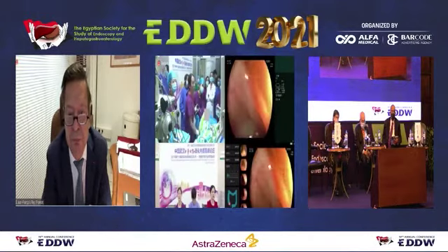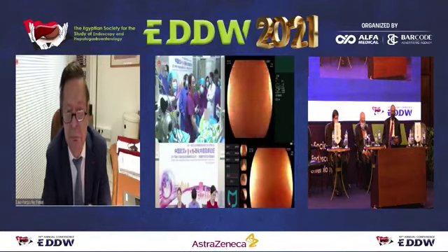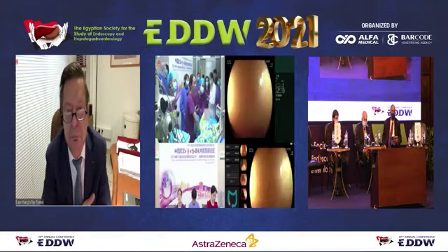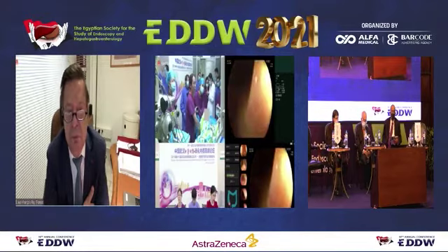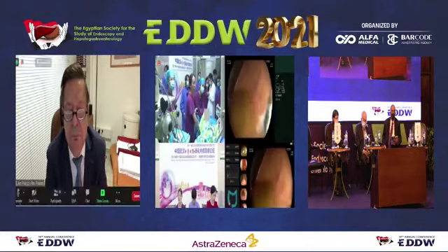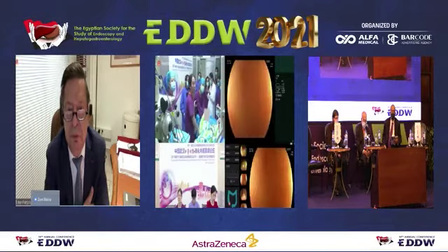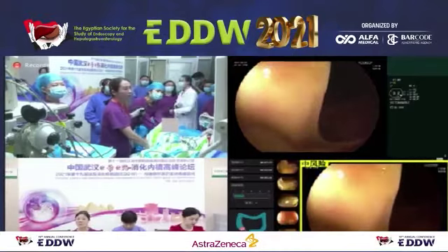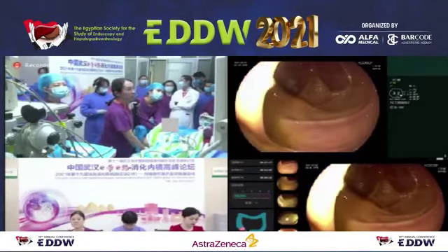If it is shown as a green square, that means the malignant possibility is very low. If it shows as a red square, that means it may be a high-risk lesion. So you can judge the malignant grade of the lesion by the color.